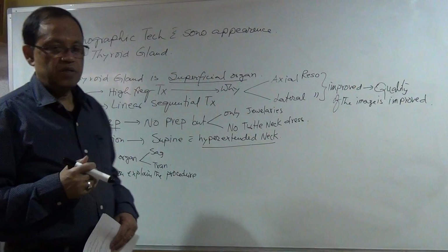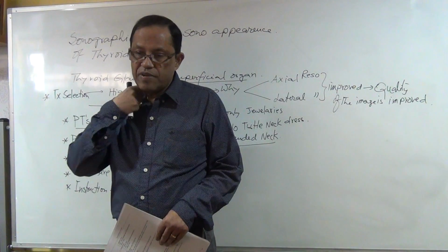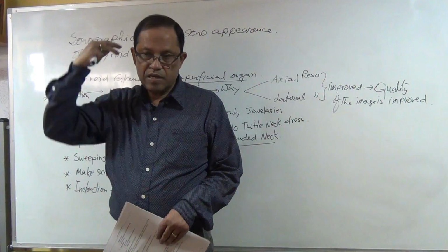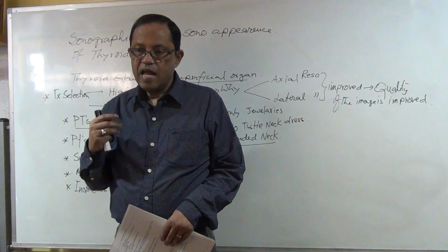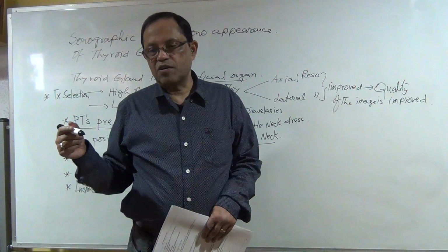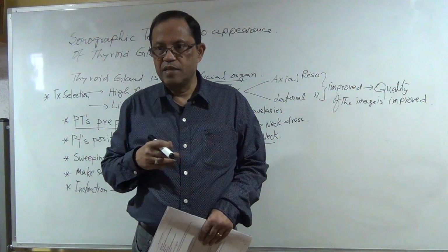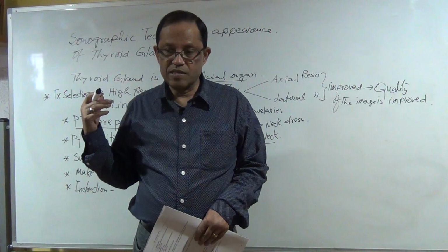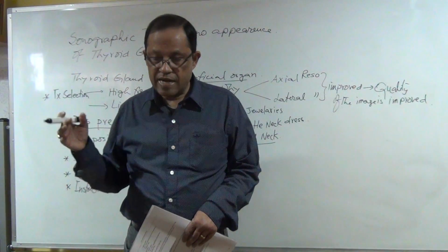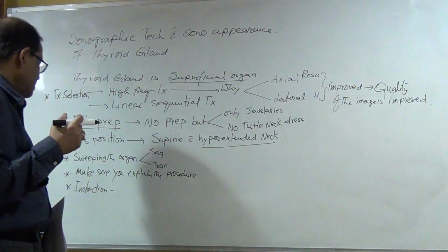Sometimes it happens. You know, the jugular vein is so superficial, right here? And the jugular vein drains the blood from the scalp area, face area, neck area. And you are scanning, and all the time you see the jugular vein is under compression. So then the patient's whole face is congested. The patient is looking at you like this. Then you have to understand what's wrong. Tell the patient that if you feel any pressure, tightness, congestion, please let me know. Okay? It is a very sensitive area.